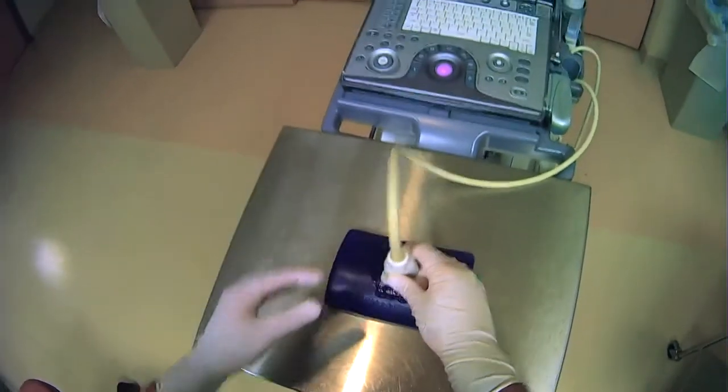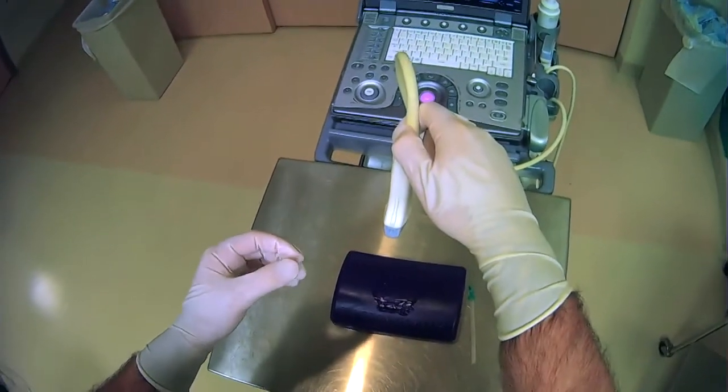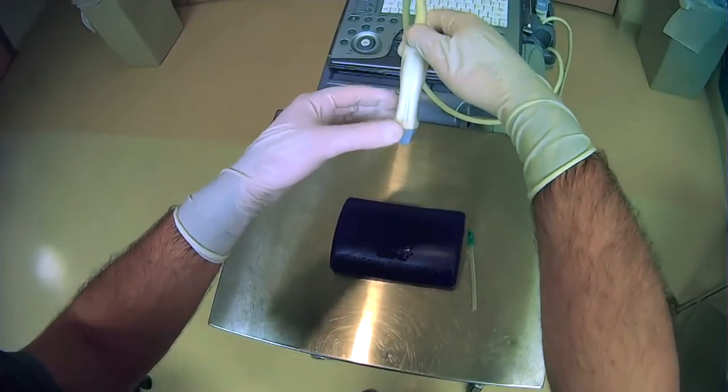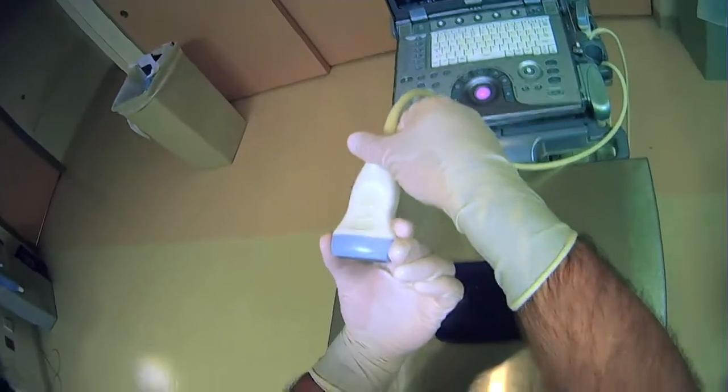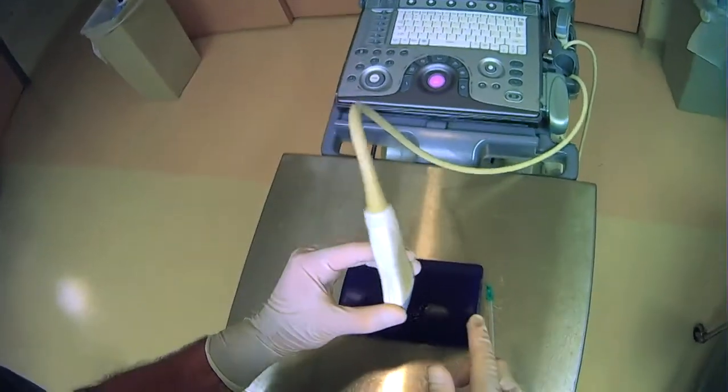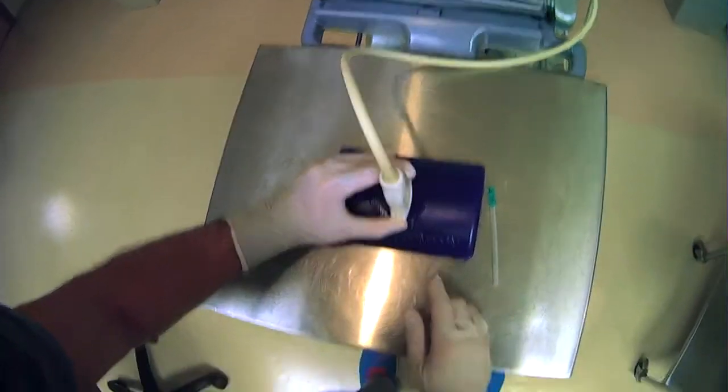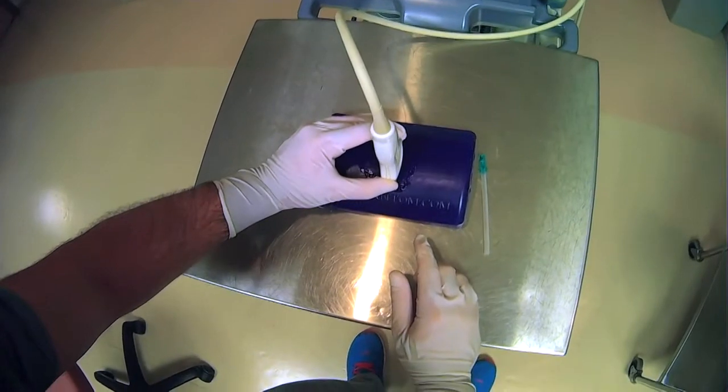You can apply the same concept to holding the probe in this orientation. You can put your thumb right here and you can put two fingers right here on the other side. And again, you can bring it down like this on the surface that you're going to be applying the ultrasound probe to.